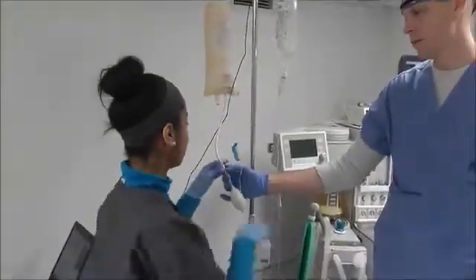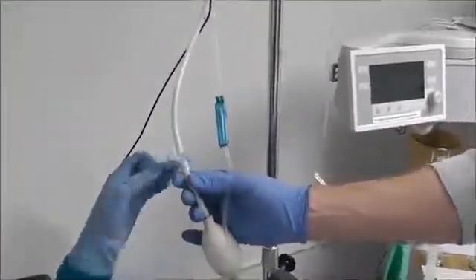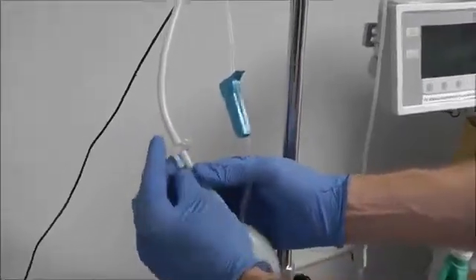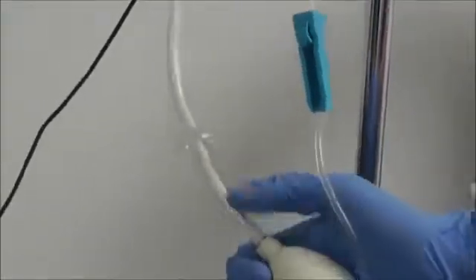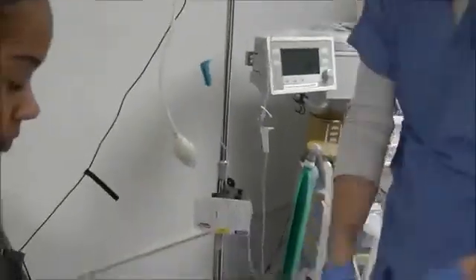Okay. And then once we're done, if we see this stopcock, where does that need to be when we're done? You want to turn this towards the bag. Right, that allows no air to escape out. When we want to take the pressure out, we just simply turn the stopcock down. But I don't want to lose my pressure. So now, once this tubing is pressurized, it's now ready to flush.